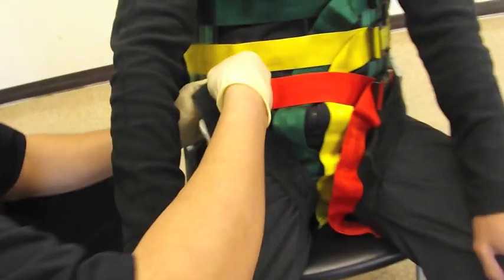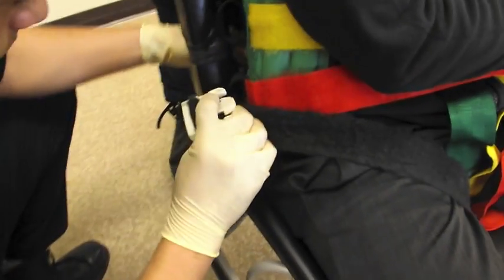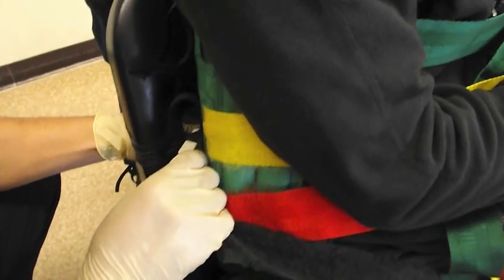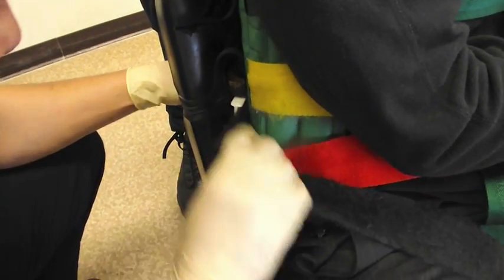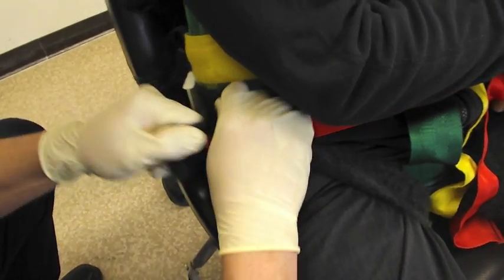As Marcus is demonstrating right now, these straps are good and snug, almost like a rock climbing harness. The same care will be taken to tighten these straps down fairly snug without causing the patient too much discomfort.